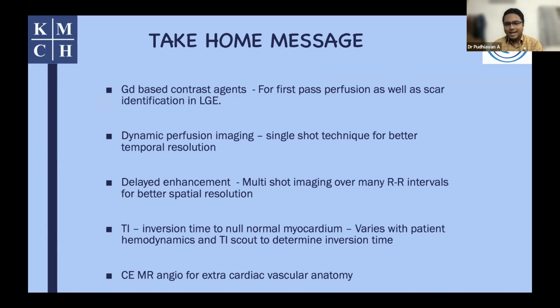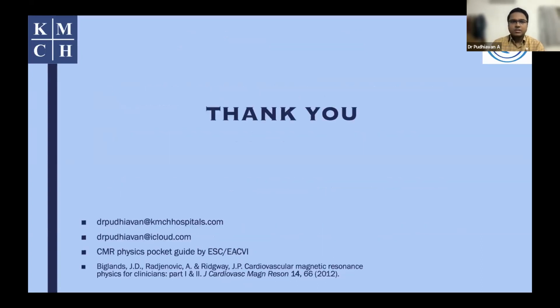And contrast enhanced MR angiography is mainly used for assessing the extracardiac vascular anatomy, especially in patients with congenital heart diseases. And thank you very much.